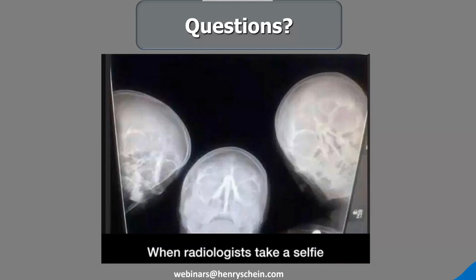Are extraoral bite wing x-rays available with CBCT? Well, most cone beam CTs that are on the market come as a pan and CBCT unit. So you can decide if you'd like to take the panoramic or not. And with that would come those extraoral bite wings.